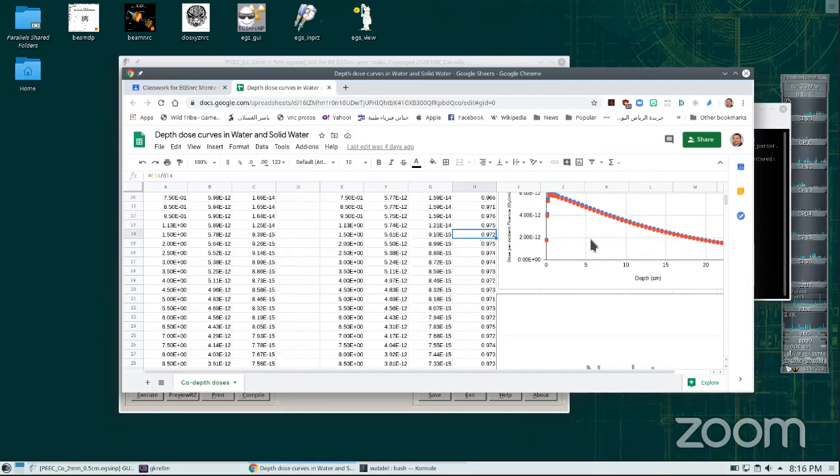This we can do actually with Monte Carlo. I think there are newer planning systems that give you the option to do the calculation in medium and so on. I don't know about the Acuros algorithm. I know you assign medium to different regions, but probably it reports the dose to water. It does not report the dose to the medium. Okay? So I don't know, what's your suggestion?